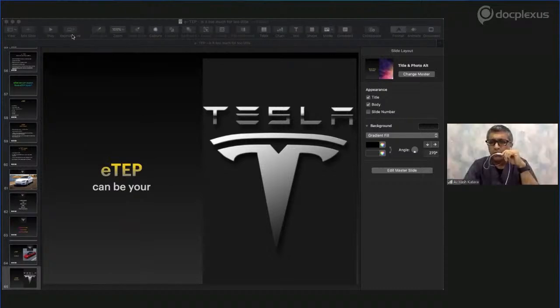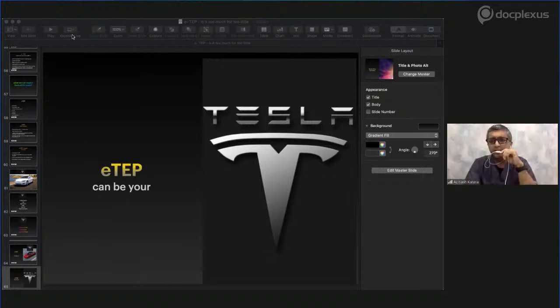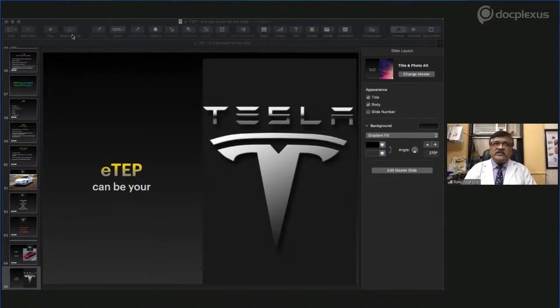Okay. And would your size of mesh vary depending on the size of the defect, in terms of the length of the defect? No, the E-TEP. I'm talking about the E-TEP now. Regarding E-TEP, we do the total retrorectus dissection. For small hernias, we dissect in the midline below the lower border of the defect. From there, at least for 7 to 10 centimeters, we dissect. There is no need to always go up to the symphysis pubis, or always up to the xiphisternum, if you are going from down up.